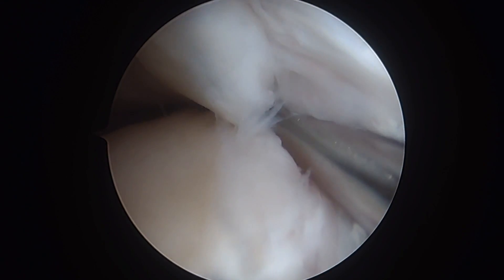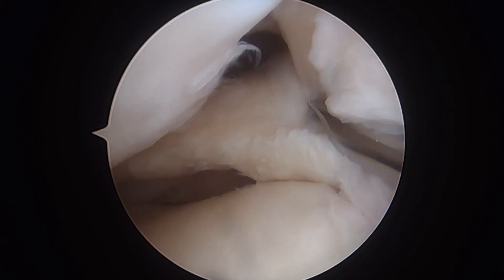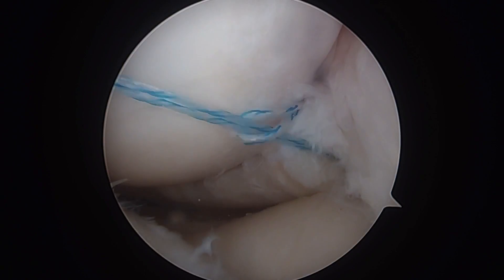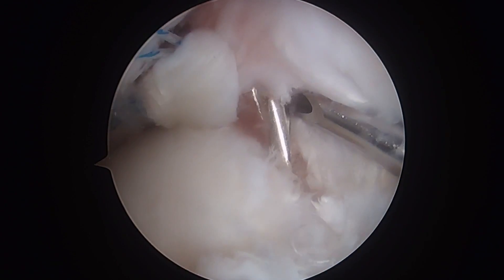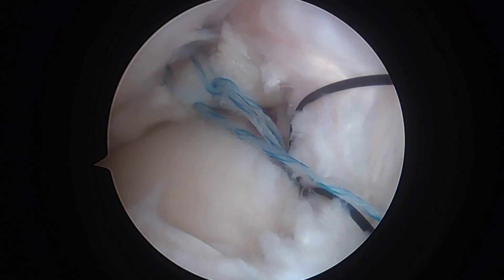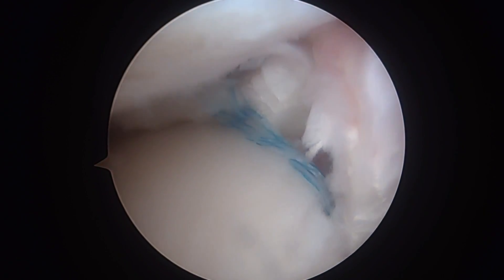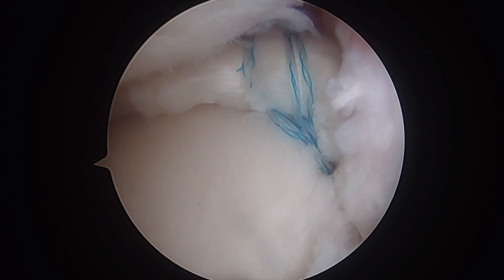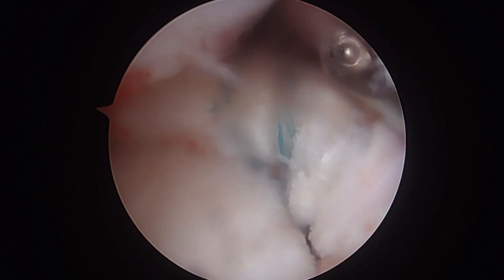The native insertion was then carefully debrided with a small oscillating shaver, with careful attention to avoid damage to the ACL graft. The terminal end of the lateral meniscus is then gently debrided of devitalized tissue. A commercially available suture passing device is then used to pass two purse-string sutures through the terminal end of the lateral meniscus. An ACL drill guide is used to pass a guide pin at the desired insertion point, and a suture passing device is used to advance the free limbs of the suture through the tibia. Adequate reduction of the terminal end of the lateral meniscus is noted, and the free limbs of the suture are then tied over a button on the tibia. The repair site is visualized arthroscopically to ensure adequate reduction.